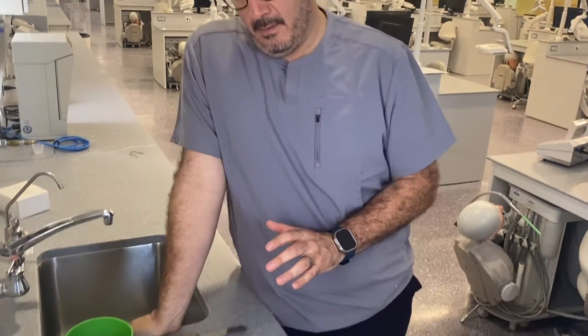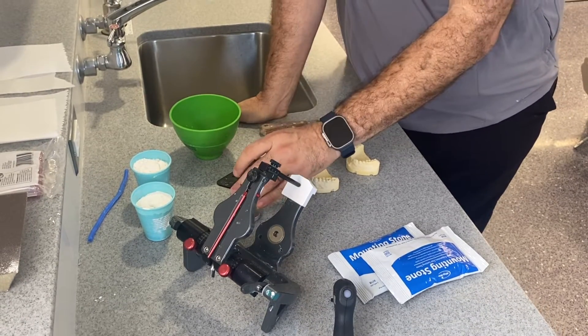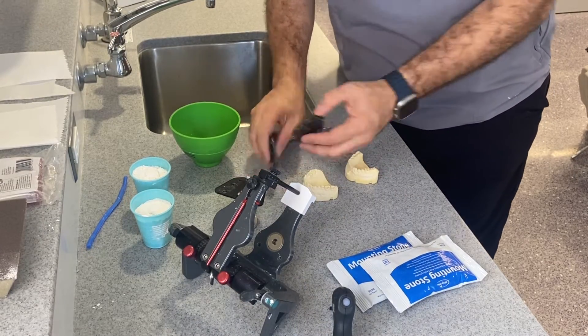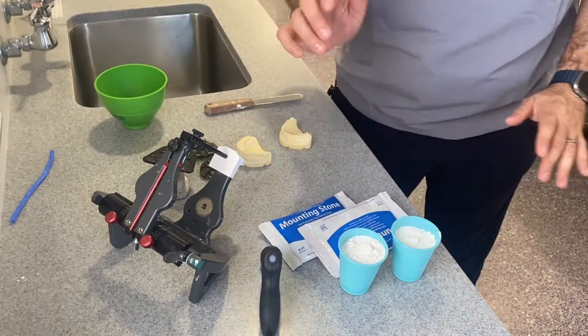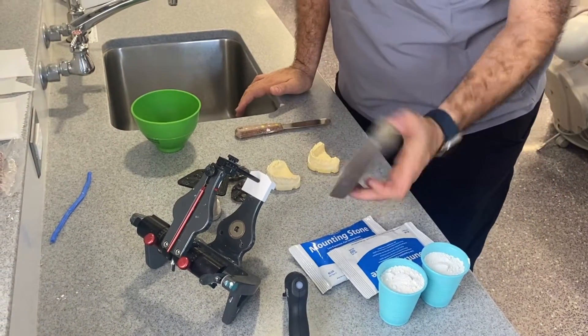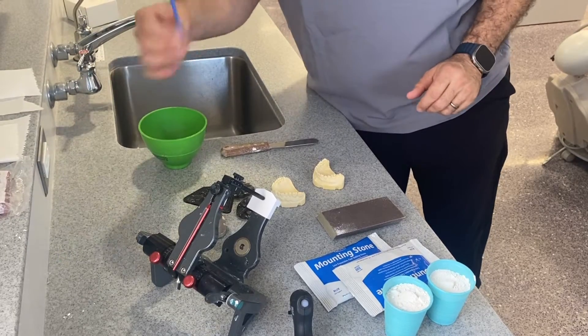This is a video for mounting your casts. The first thing we need is your semi-adjustable articulator. We're going to be mounting with the universal mounting table rather than the face bow. You'll need two sets of mounting plates, mounting stone, plaster, a hot glue gun, your sanding instrument, and some rope wax.